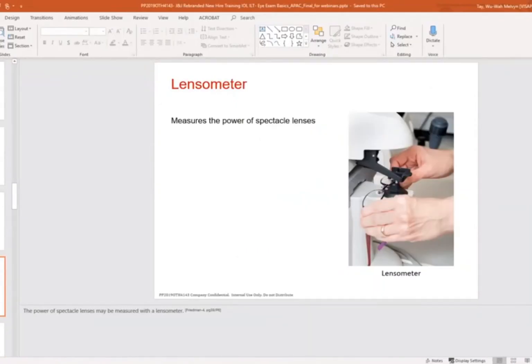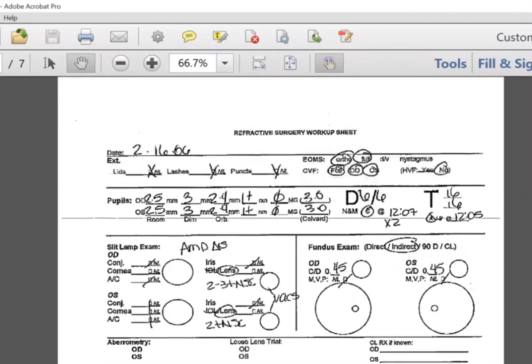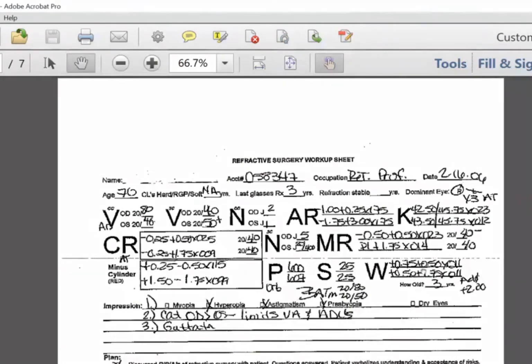An indication of that in the case sheet looks like this. So they would have some kind of refractive power indicator. It looks like refraction, but it is indicating the actual power of the patient's spectacles. So the sphere power, the cylinder power, and the axis of the cylinder. And this spectacle is worn for 3 years. It has an add power of +2, so it's a bifocal lens that has some additional power for near vision, right? And so that's what the patient is wearing.